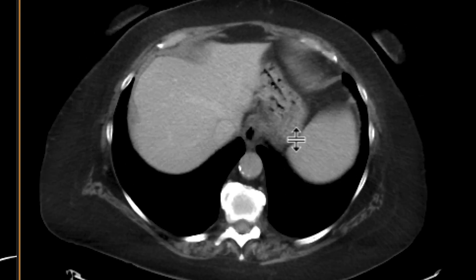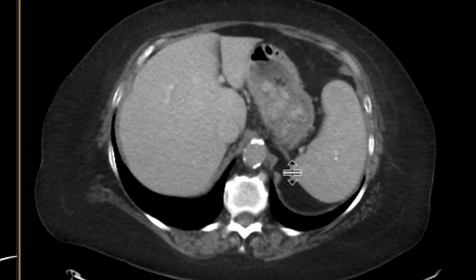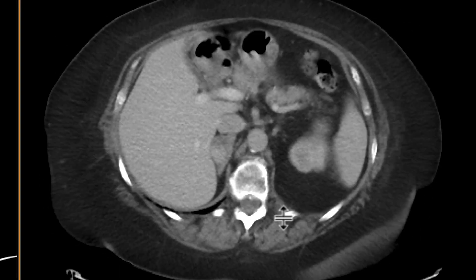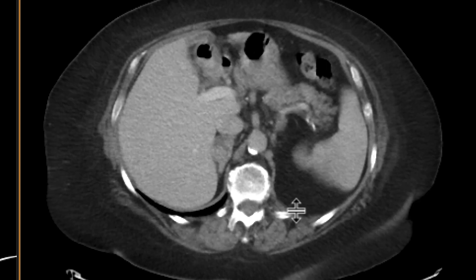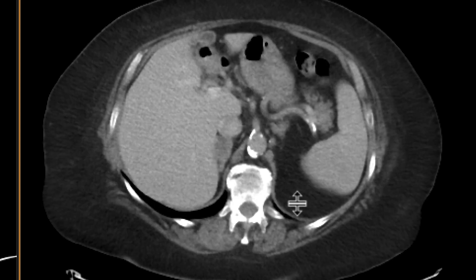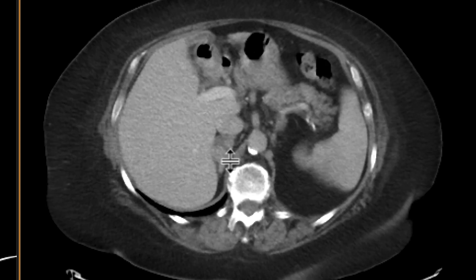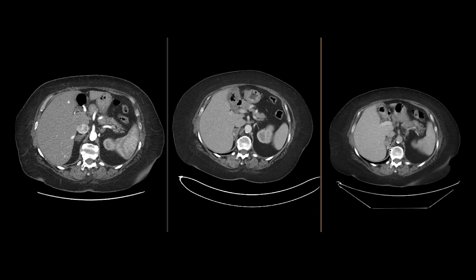Another couple of months go by, and we reevaluate this adrenal lesion. We can see that the enhancing nodule is increasing in size. Looking closely, there are also other enhancing nodules within this adrenal mass. This is a great example of a collision tumor, where you had a pre-existing adenoma in which metastases spread to.